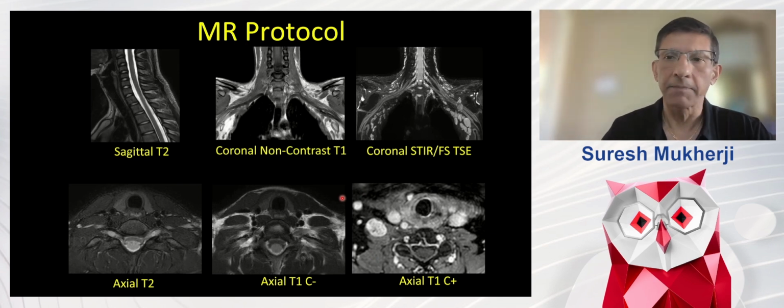In general, my approach is, the shorter the MR protocol, the better the images turn out. Because I don't know if you've been in an MR recently, but they're still pretty loud, they're still pretty narrow. And the longer you're in there, the greater likelihood you're going to move. And I like to keep my sequences short because if you have a 5-minute sequence and the patient moves at 4 minutes and 30 seconds, you've lost that whole sequence.